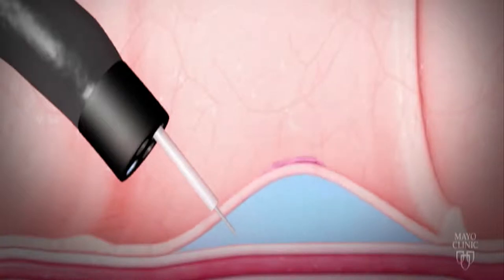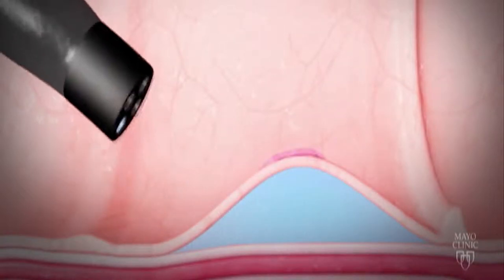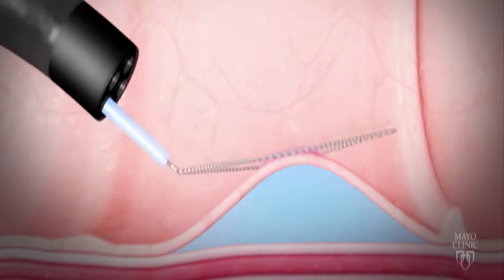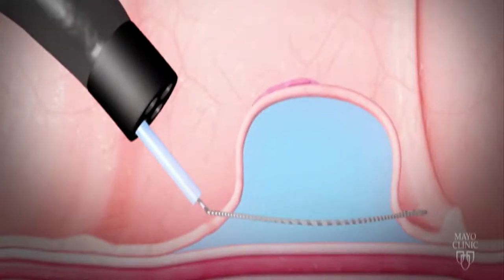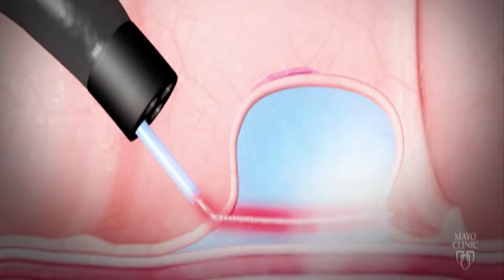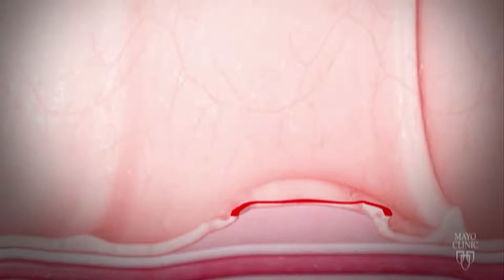The site is injected with a long needle with a saline solution to lift the polyp. The polyp tissue, as well as a small amount of normal tissue, is usually grabbed with the snare device and resected. And lastly, the site may be closed with metallic clips to prevent future complications.